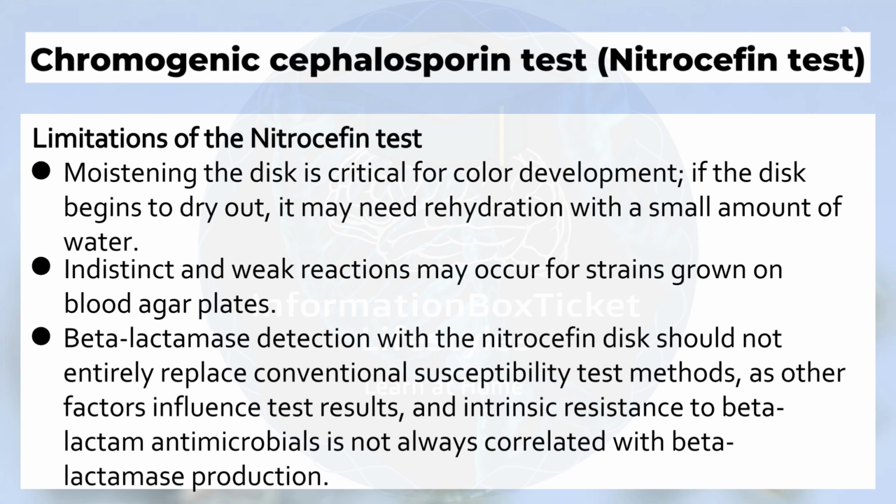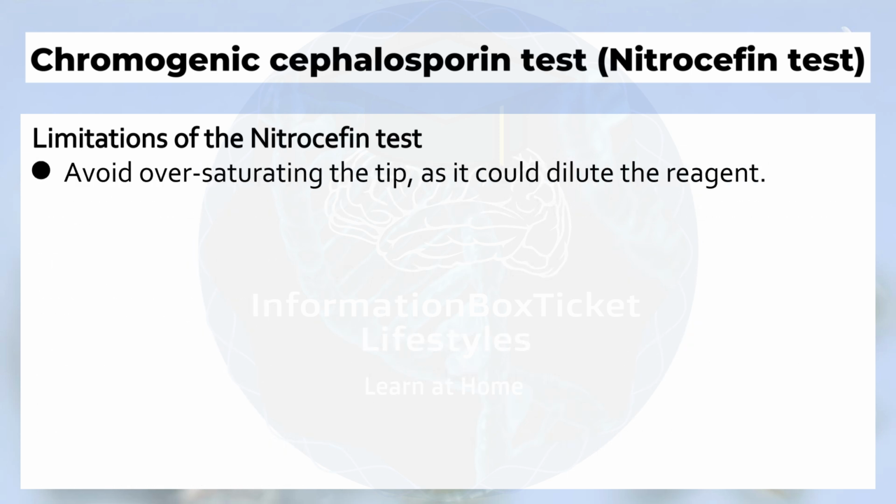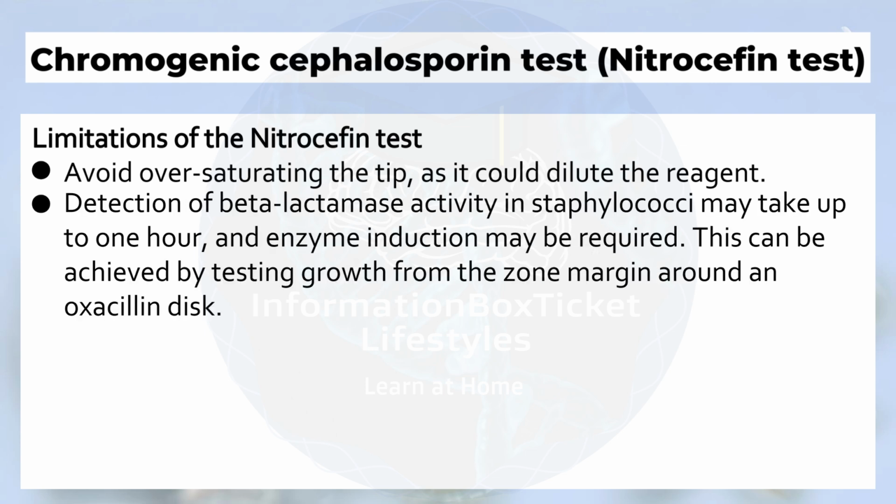Beta-lactamase detection with the Nitrocefin disc should not entirely replace conventional susceptibility test methods, as other factors influence test results, and intrinsic resistance to beta-lactam antimicrobials is not always correlated with beta-lactamase production. Avoid oversaturating the tip, as it could dilute the reagent. Detection of beta-lactamase activity in Staphylococci may take up to 1 hour, and enzyme induction may be required.